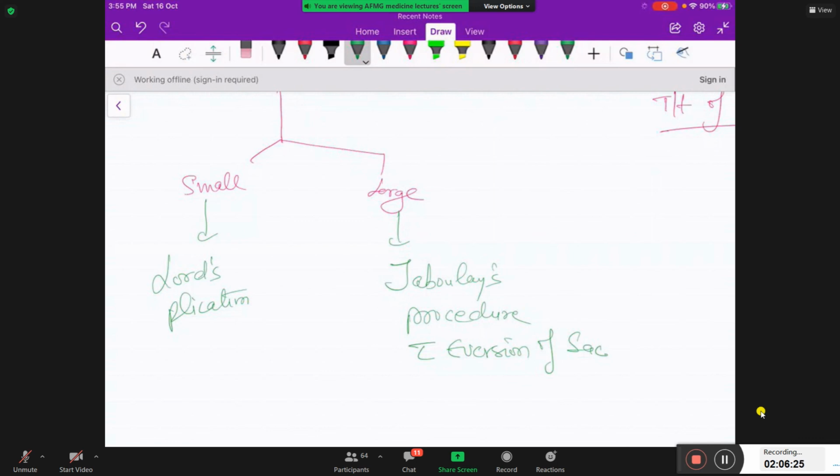देखो इसमें क्या कर रहे हैं हम, just to make you understand. क्या problem है? The problem is the tunica vaginalis is not absorbing the fluid. So what we do, we give an incision on the tunica vaginalis. Tunica vaginalis को हमने खोला और ऐसे किया और जैसे plication, you have seen the curtains. Curtains को plicated curtains होते हैं ना, जैसे ये plications है. इसको हमने ऐसे फोल्ड किया, tunica vaginalis को ऐसे फोल्ड करके इनको आपस में ऐसे सूचर कर दिया. This is called Lord plication, right?